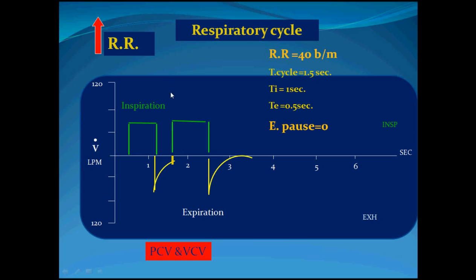So the increase in functional residual capacity is due to accumulation of part of the tidal volume which is not exhaled. This leads to hyperinflation of the lung. In a normal person, this means that the tidal volume will decrease because of the increase in the functional residual capacity, and the patient becomes hypoventilated. This is what we usually call shallow rapid breathing. Shallow rapid breathing is hypoventilating breathing.